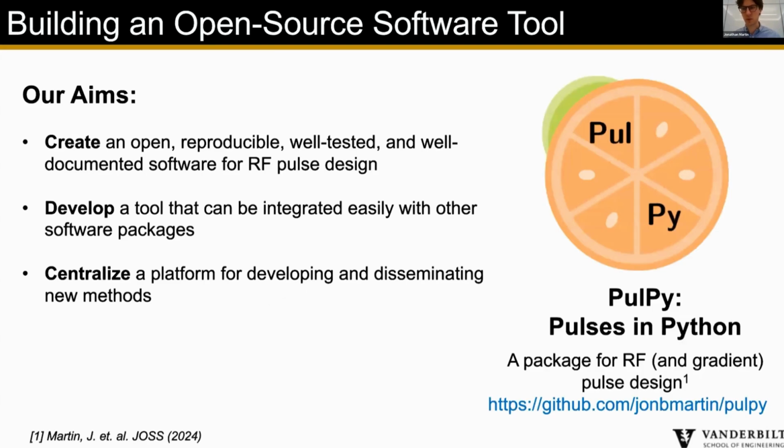And the solution we came up with is a Python package that we're calling Pulpy, Pulses in Python. It's a package for RF and also some limited gradient pulse design.